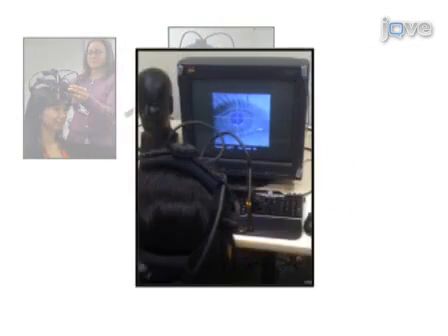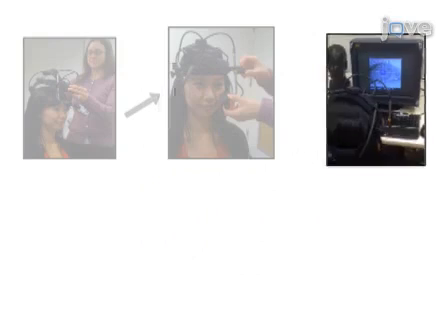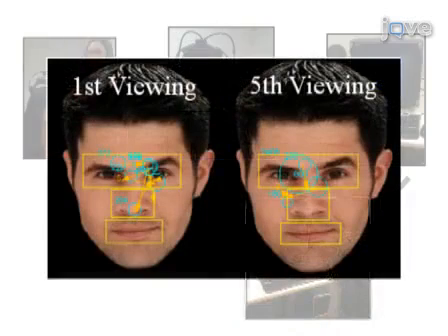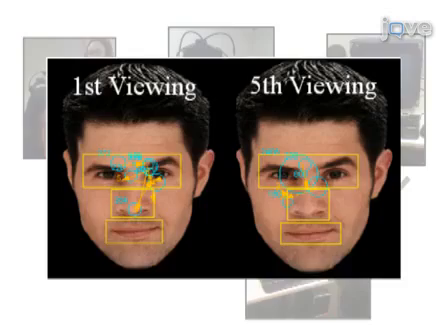The cameras are focused to obtain pupil and corneal reflections. By having the participant fixate on a series of targets, eye movements are calibrated and validated. Through inspection of changes in the eye movement scanning patterns, it can be shown that details regarding previously viewed images have been stored in memory.